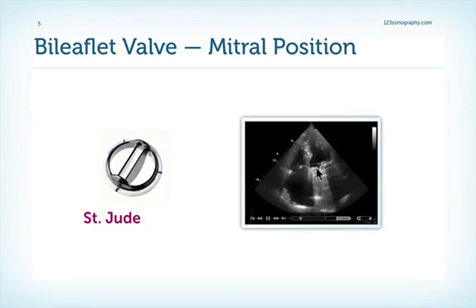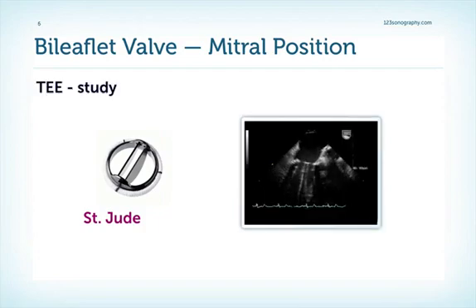What we also see is, again, the shadowing of the valve, and in particular, we see those two little dots. Sometimes we don't really see the entire leaflets, but only these two dots, especially in the open position. So remember this pattern, and remember to also rotate the transducer around the mitral valve until you really see those two little leaflets. It is not always possible to really delineate the two leaflets from a transthoracic approach. From a transesophageal approach, it is much easier.